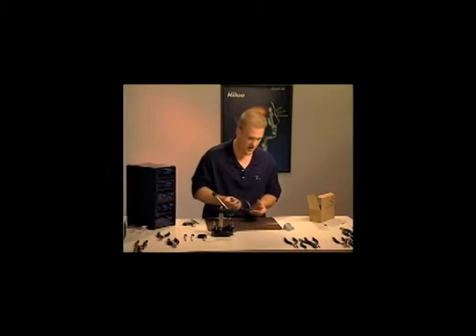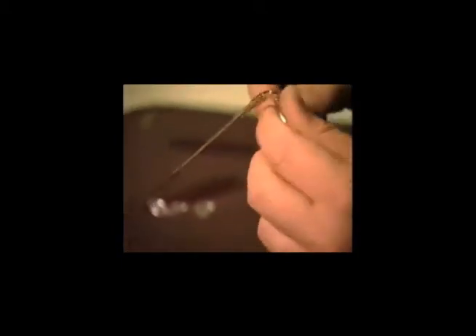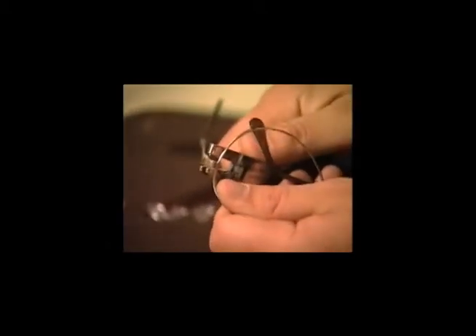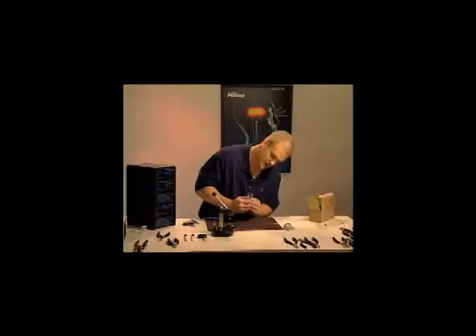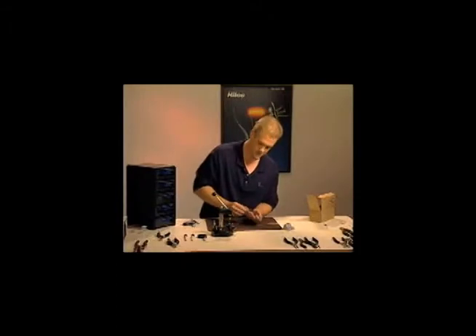And I have a frame here that has frozen screws, and I'm going to try to punch those out. And we'll do the temple hinge first. What we're doing is lining up the head of the screw to pass through that opening in the jaw. And we have the pin over here that's actually going to punch out that screw. It's important to get the pin as close to center on the screw as possible. Make sure that the head of the screw is passing through the jaw, and then you squeeze it. And it punches the screw out.